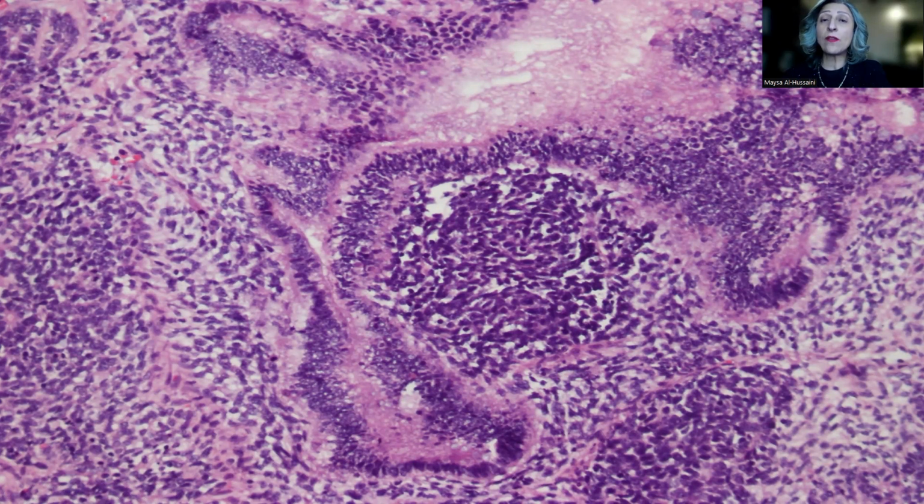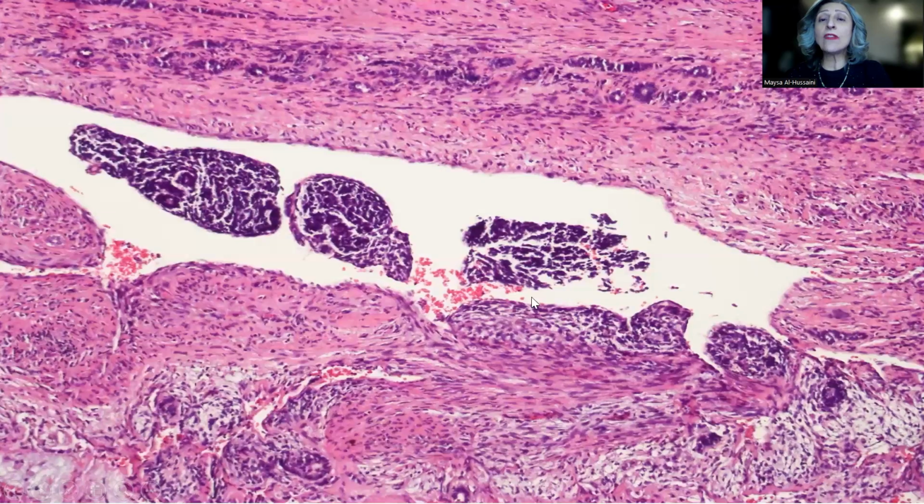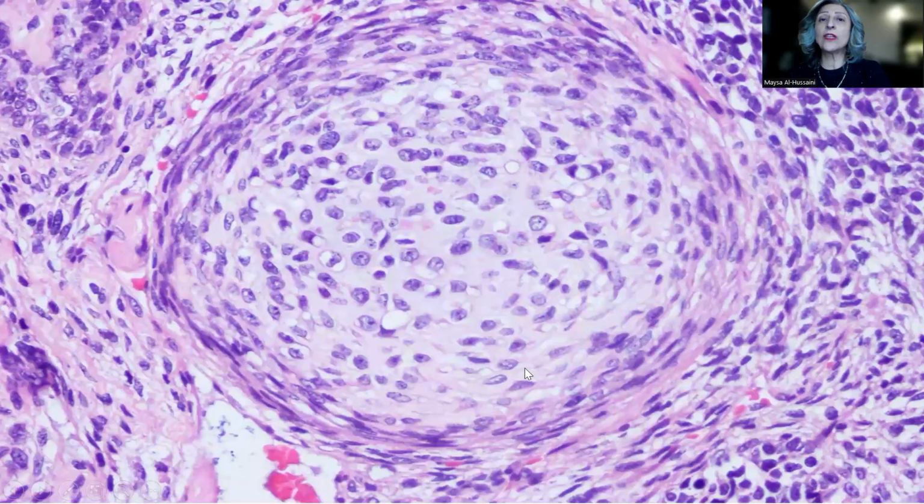Nowadays, as per the new WHO classification, we do not really assign this teratoid term to the Wilms tumor or nephroblastoma. We only say that the epithelium shows some evidence of heterologous differentiation in the form of a mucin-producing epithelium, and the stroma shows evidence of heterologous differentiation in the form of cartilaginous differentiation, not more than this.